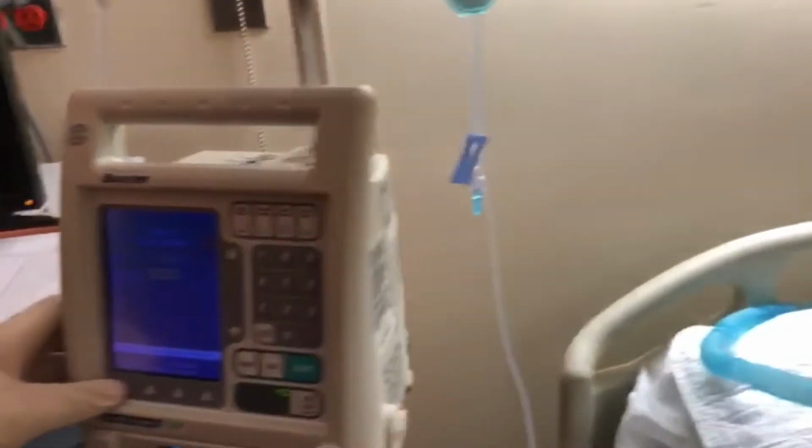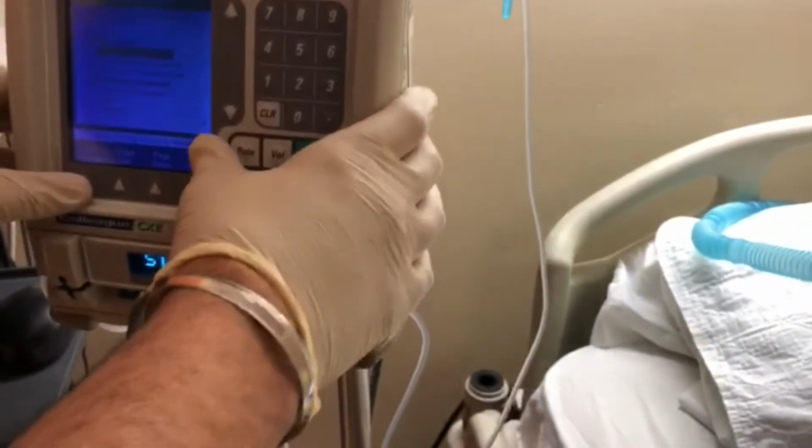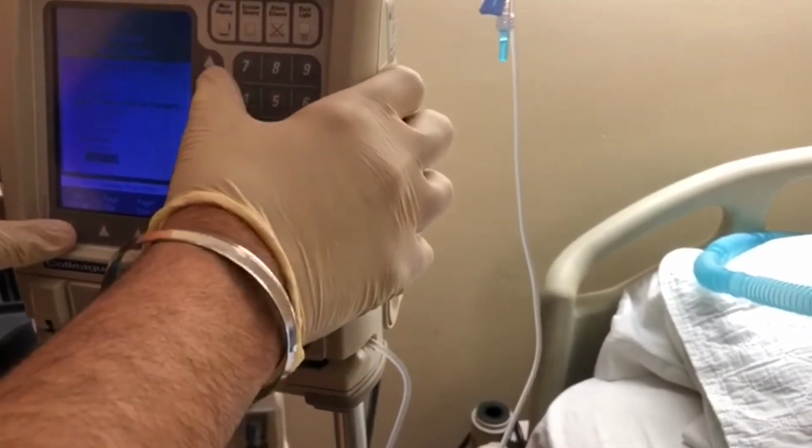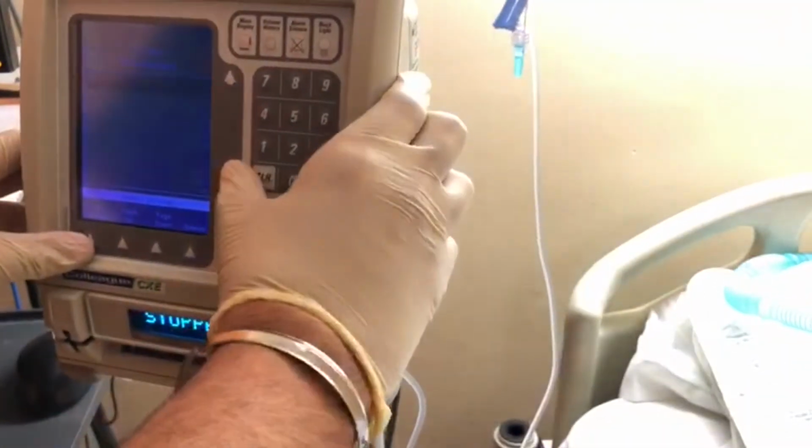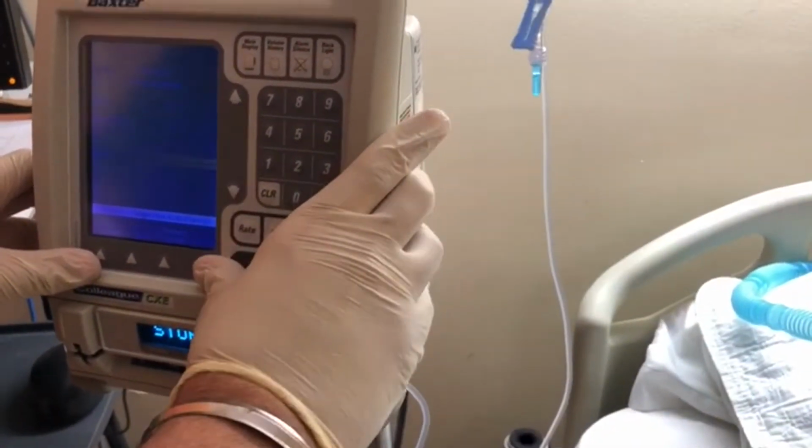And then we also want to change mode, go all the way up, and we want to label it. We want to find where it says TPN, which is right there. So we can select that and label the TPN.